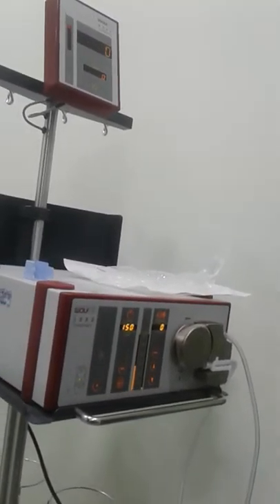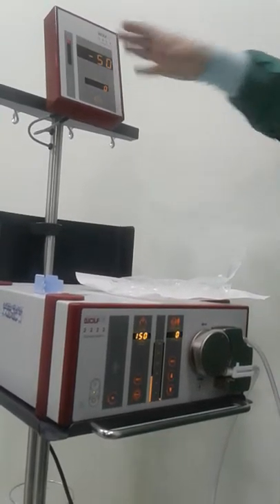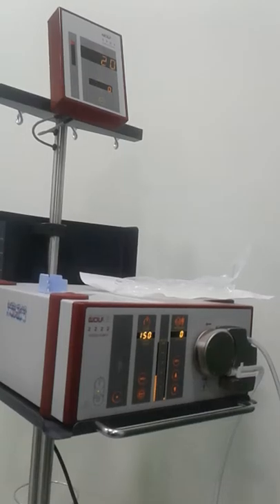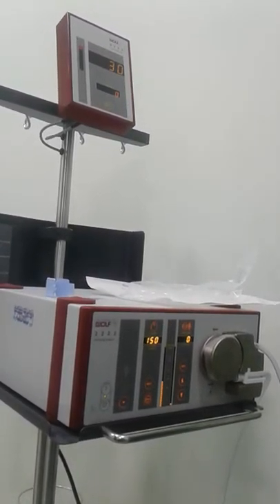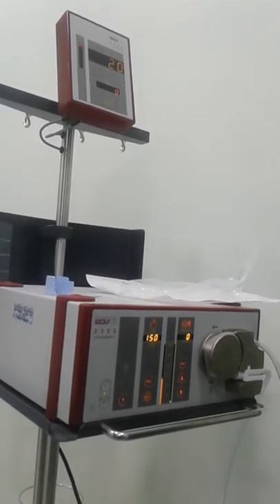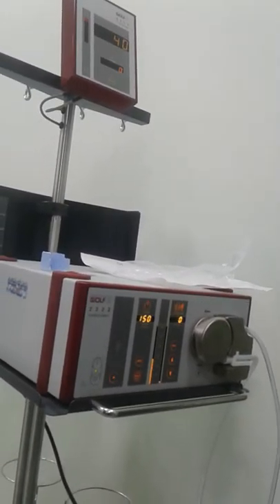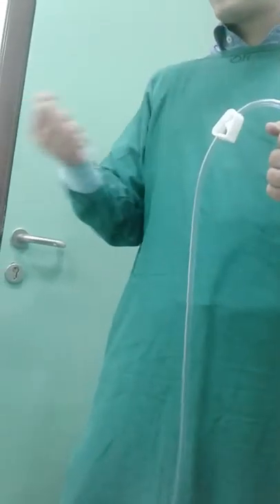Okay. So how is this? But we can test this, unless we are using it in an operation. It measures the pressure inside the uterus. Okay. So just demonstrate to us what this is and what it is used for. This is to be connected to the hysteroscope. Yeah, this is for irrigation.